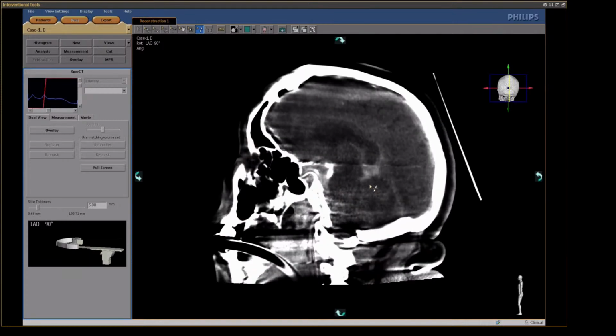Okay, it's 7 minutes after the stent placement. We can check one more time.